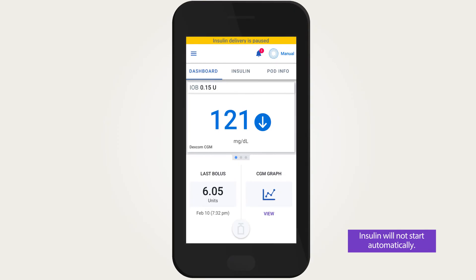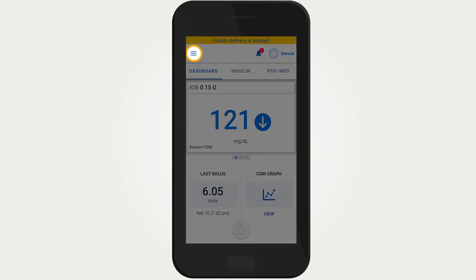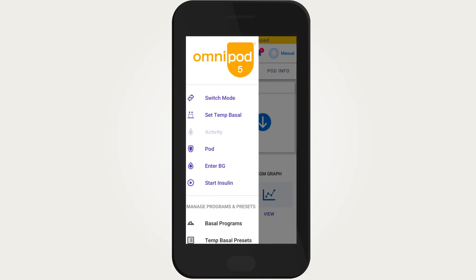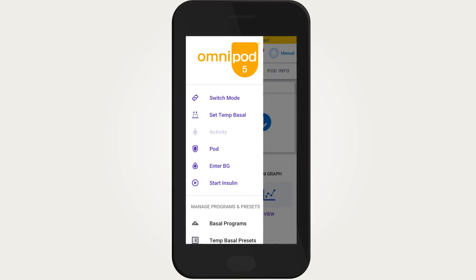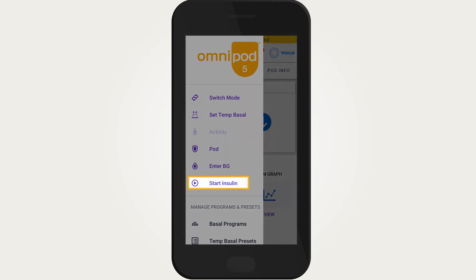When you tap on the menu button while insulin is paused, start insulin will replace pause insulin on the menu. Tap start insulin to resume insulin delivery.